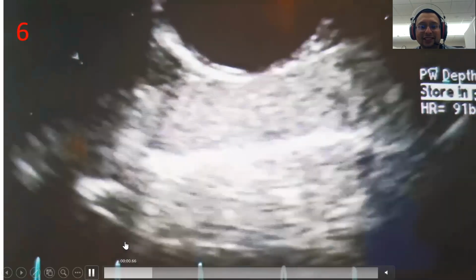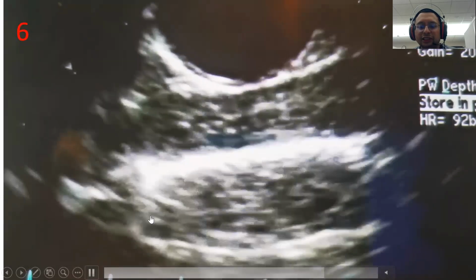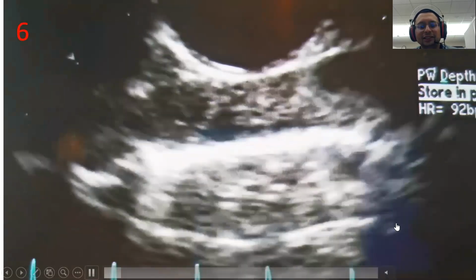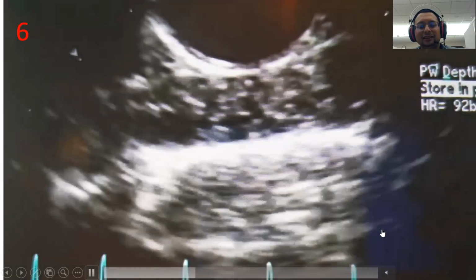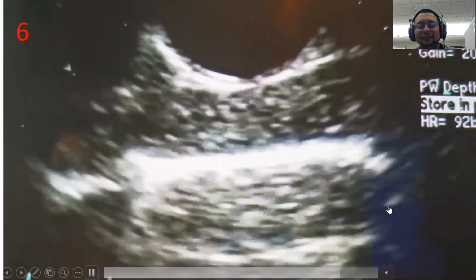Side by side, SVC and IVC, okay? Right? Okay, so that is not, let's see, I say this is also SVC. So what is the diagnosis? Is it the cardinal vein? No, it's also SVC. Oh, it's also anomalous.